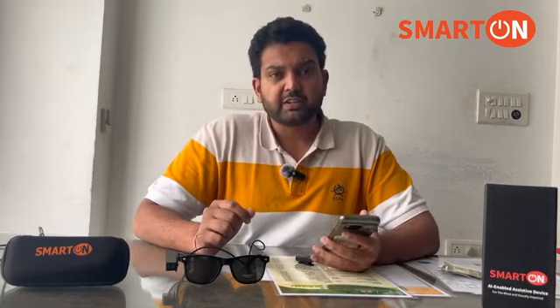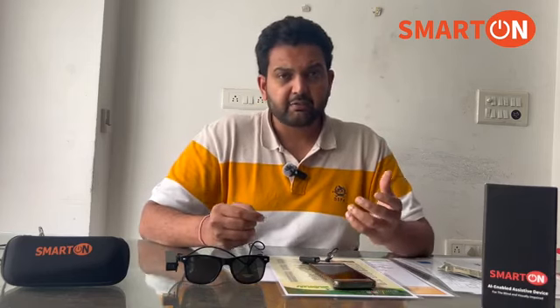What this essentially is trying to do is that not every time you will need glasses to wear while you're doing an activity. So suppose you're on the roads or going to an unknown place, you may not want to hold the phone all the time. But what you can now do is wear the glasses connected with your phone, keep the phone in your pocket, wear an earphone, and you can still access information.